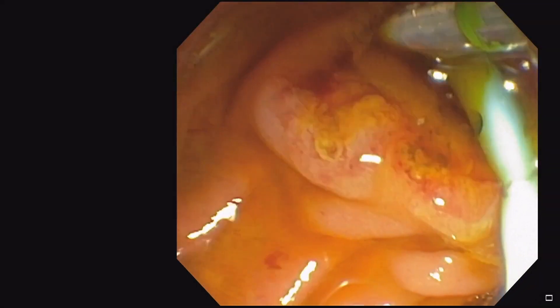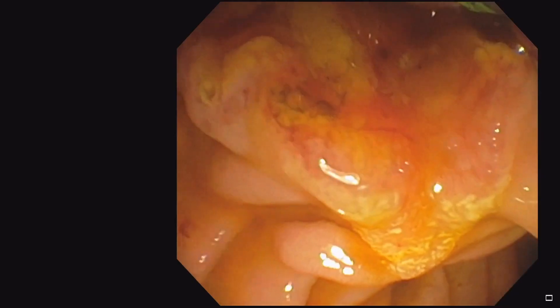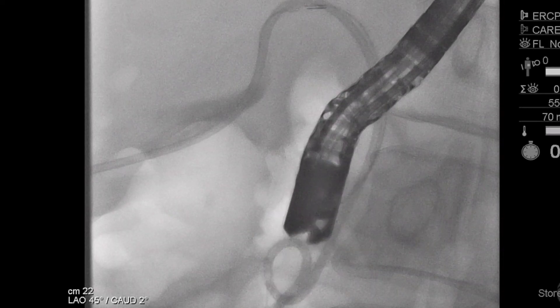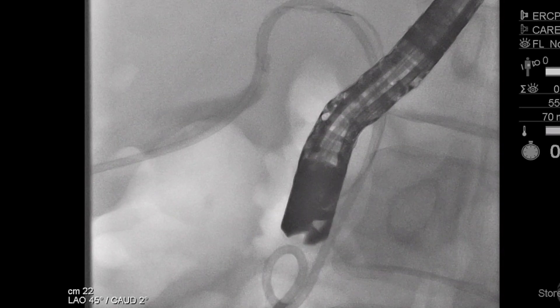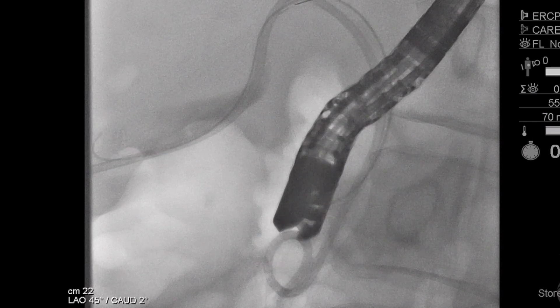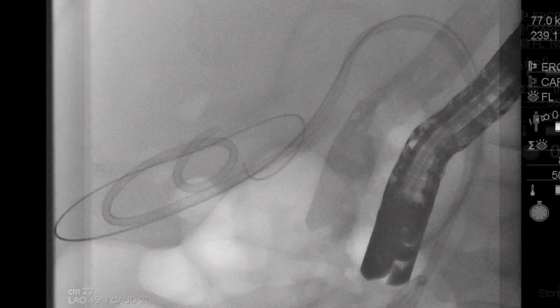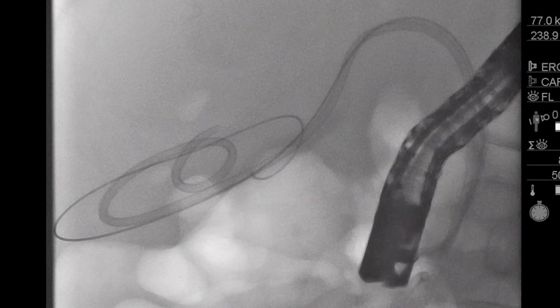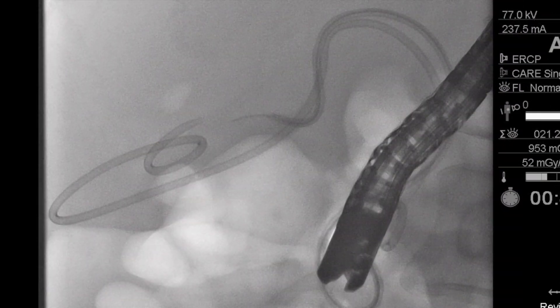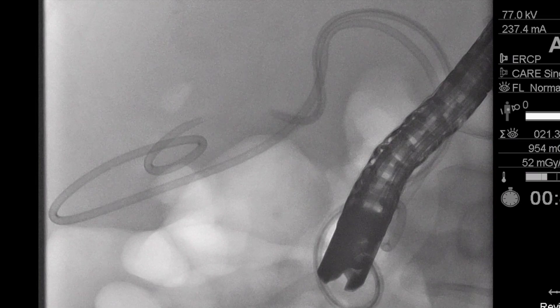To accomplish dual stent placement, the prior steps are essentially repeated, with passing a wire into the gallbladder and adequate loop formation, followed by deployment of the second parallel stent through the cystic duct and into the small bowel.